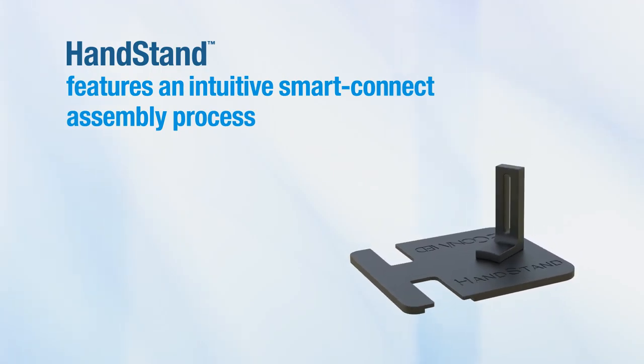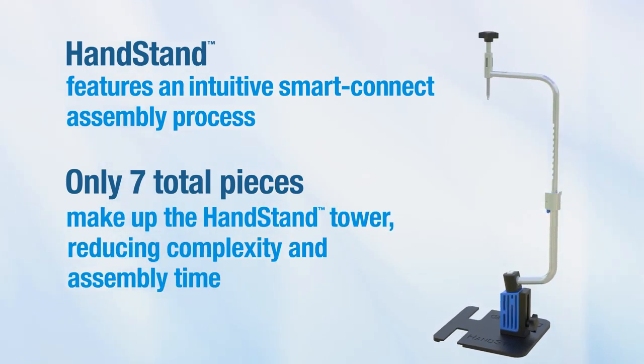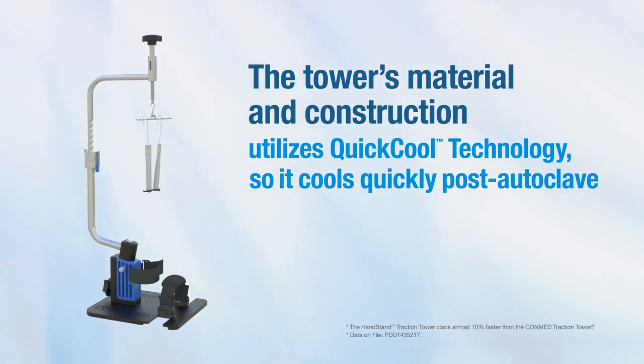Handstand features an intuitive Smart Connect assembly process. Only seven total pieces make up the Handstand Tower, reducing complexity and assembly time. The tower's material and construction utilizes quick-cool technology, so it cools quickly post-autoclave.